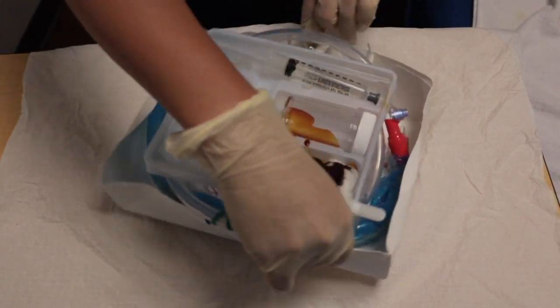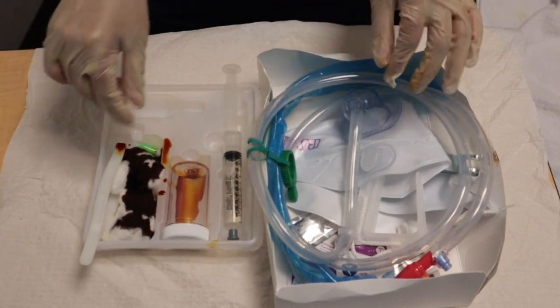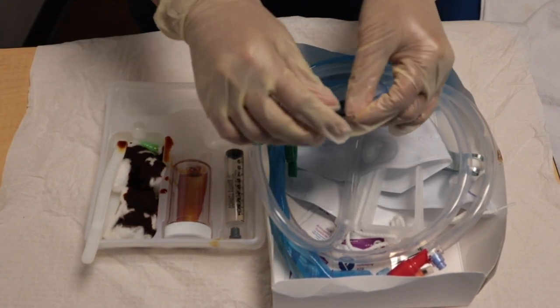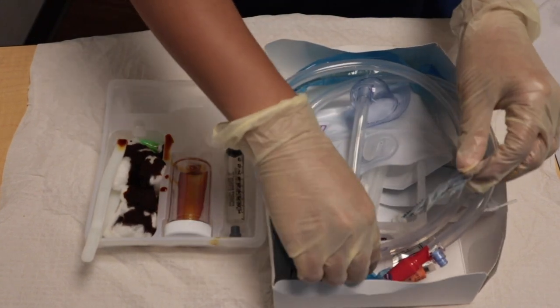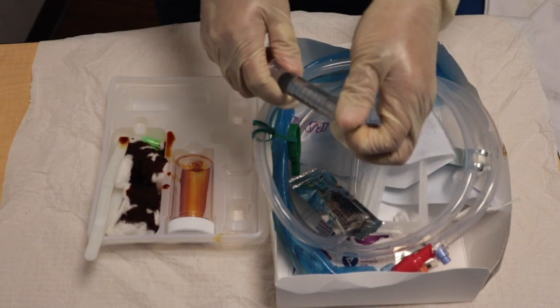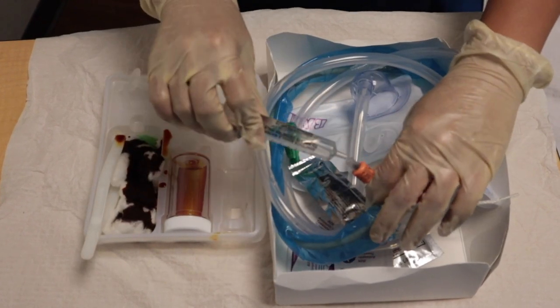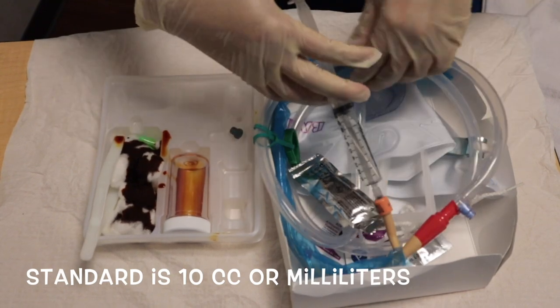Turn the kit around and put it on the side. Don't cross that invisible outside 1-inch margin. Then grab the lube packet that is provided inside. Tear it open. Put it back inside. Now, grab the syringe and connect it to the port that has writings on the side. That also tells you how many cc's to push in. Standard is usually 10 cc's or 10 milliliters.